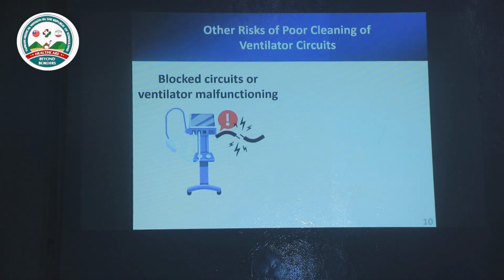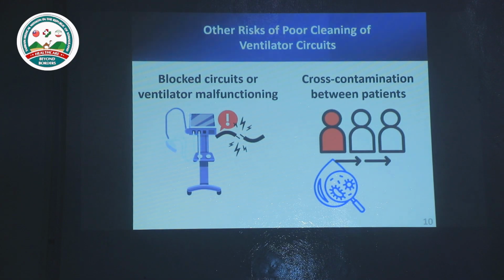Another risk of poor cleaning of the ventilator circuit is blockage of the circuits, or condensed water flowing back into the machine and causing ventilator malfunction. Another thing is that because we have only a few ventilators, we sometimes need to shift a ventilator to other patients, and if we have poor cleaning, this can cause cross-contamination between patients.